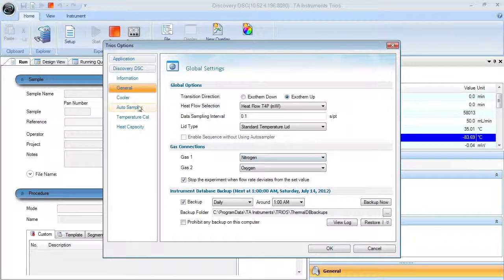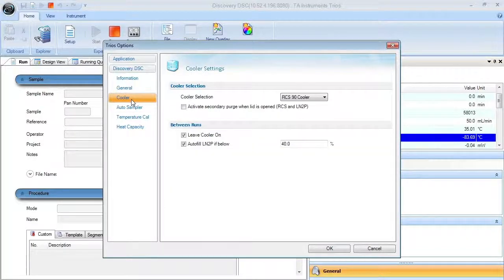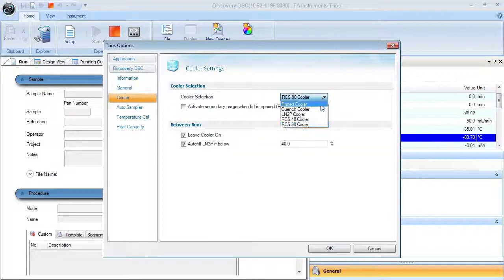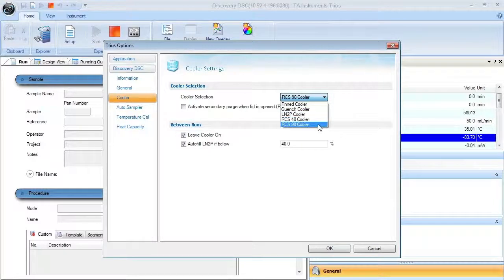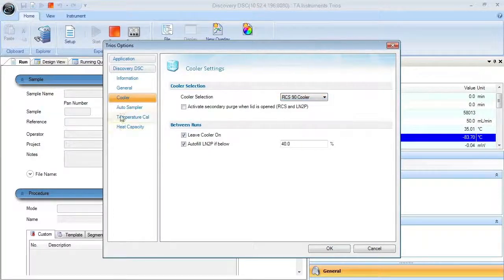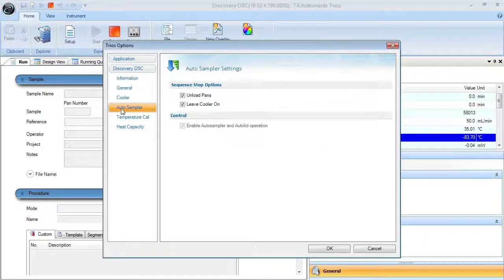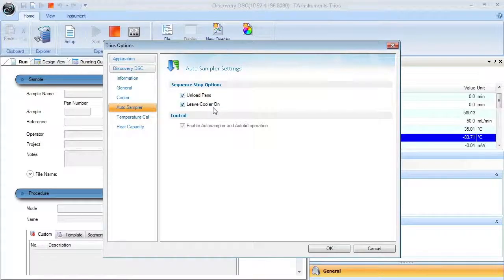The cooler tab allows selection of the cooling unit. The auto sampler tab allows for sequence stop options.